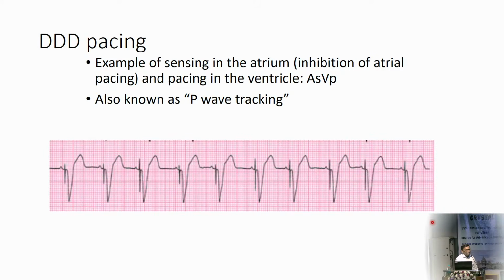So the physiological natural pacemaker, the SA node, is very good, and the only problem is below the AV node. So here A sense and V pace is going to be maintained by the pacemaker. Based on the patient's physical activity, the heart rate increases and reduces naturally, like the SA node does, and ventricular pacing just follows the atria.